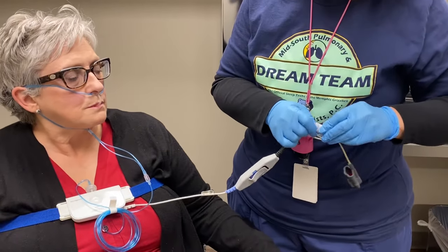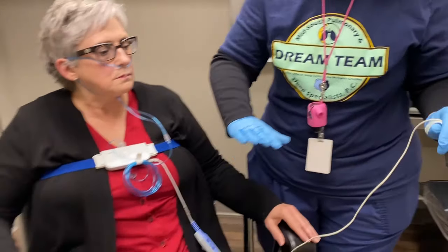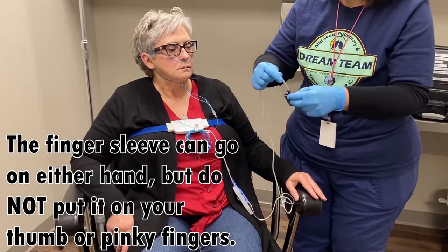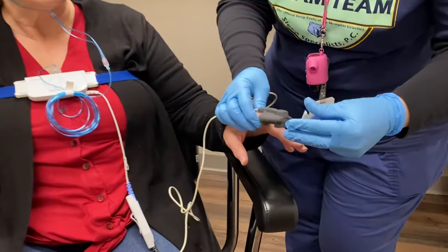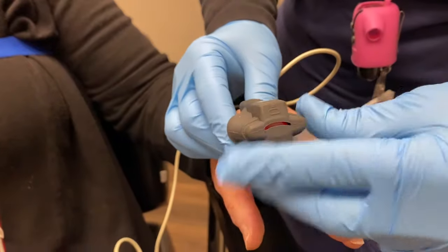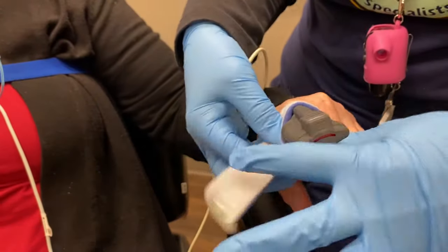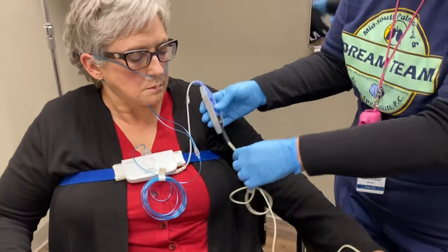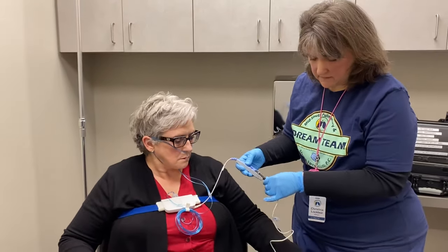The last piece will be your oxygen and pulse sensor. It can go on either hand, any finger except we don't want it on your pinky or your thumb. On any of these three fingers on either hand, place it with your palms down — you want the cord to be up. Whichever finger you choose, insert your finger until it reaches the top; you don't want it to actually protrude. You just want it to reach the top. Then you can use the wrap to keep that in place. There's also a clip on here — you can clip it on your pajamas or on the belt if you feel like you need extra security.